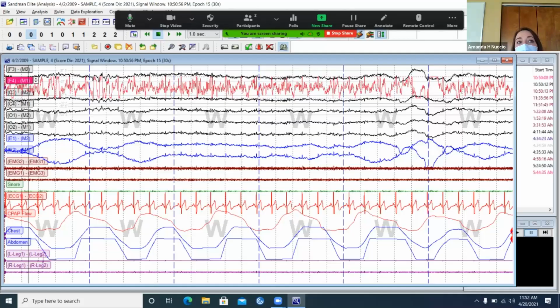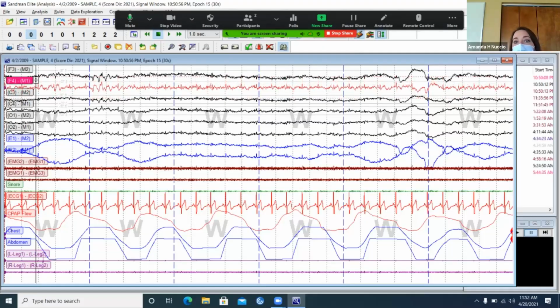And it can work the same way where maybe we do have slow wave sleep, but we make it so small that you're second guessing what you're looking at. So you always just want to take it as it comes.